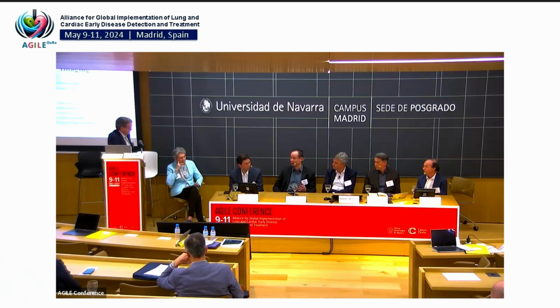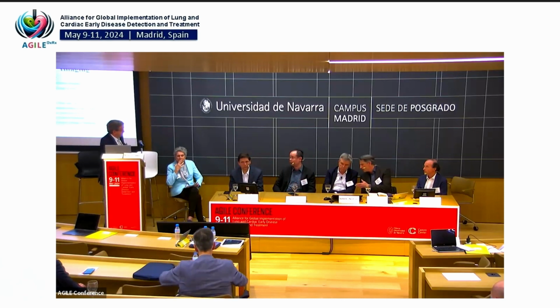One of the key things is that these software packages have publications that back up their reliability or accuracy, but then again, each software package is tested on a completely different patient population. So ideally, you want the packages to be tested from a common database. It's almost like a shootout where you want to know which package is better, but there's no way to test that.